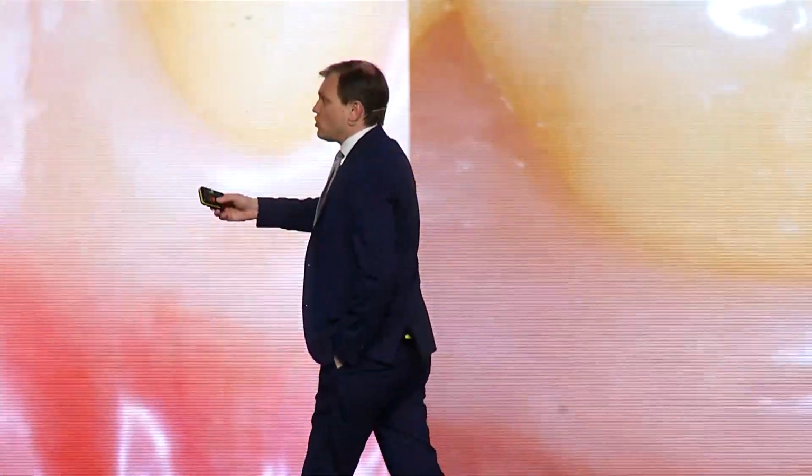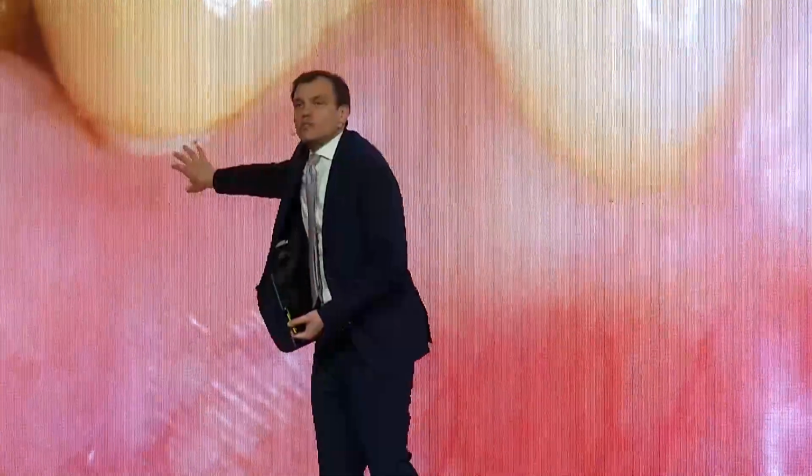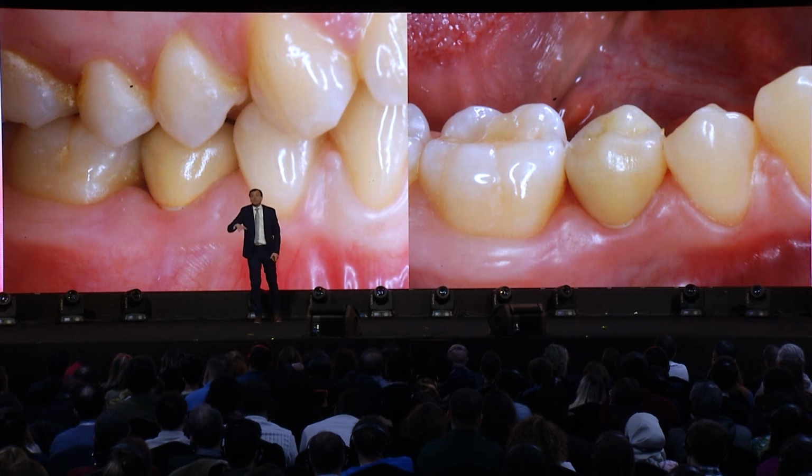And for checkup, the patient comes, and I see this white line. I'm picking up the explorer, the probe, and I try to remove it, thinking that this is cement remnant, which I was not able to remove. But I slowly realized that this is not a cement, this is the supragingival margin on the individual prosthetic abutment. I just made it unintentionally higher. Now I would do that intentionally, because we all know that if you cannot see the margin, you won't be able to clean the cement.